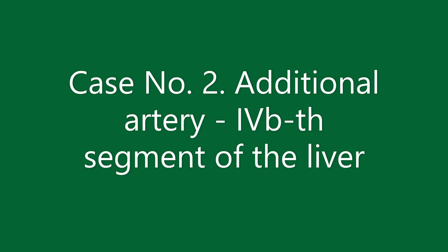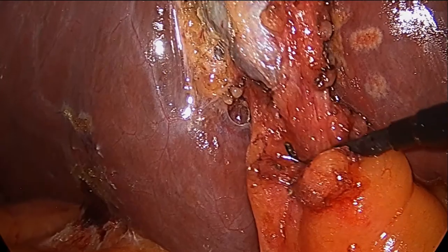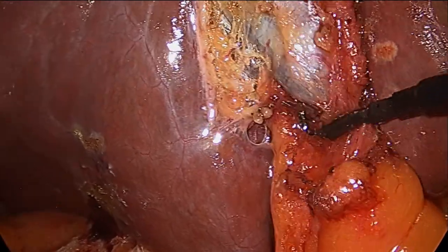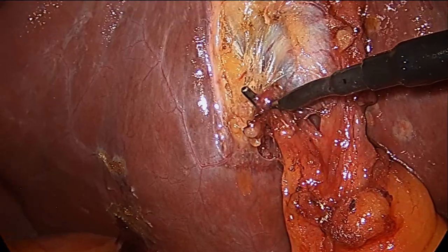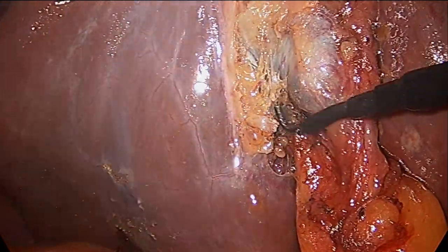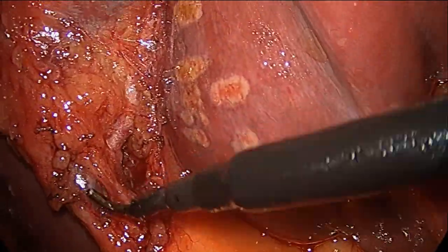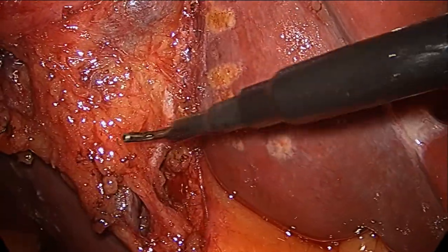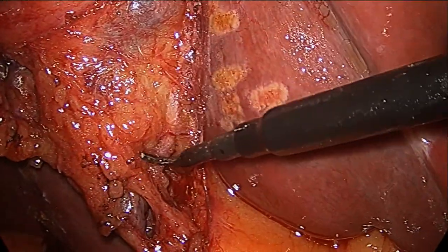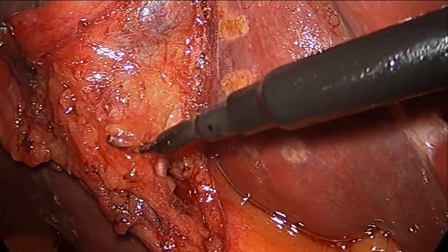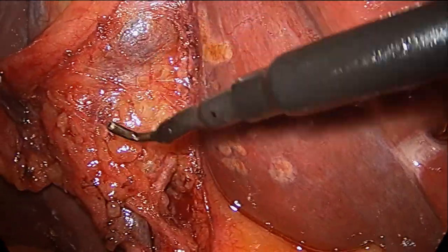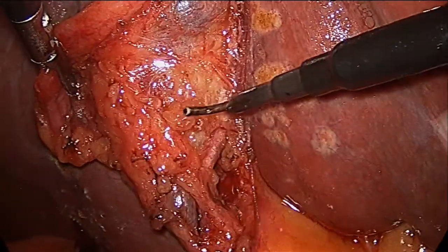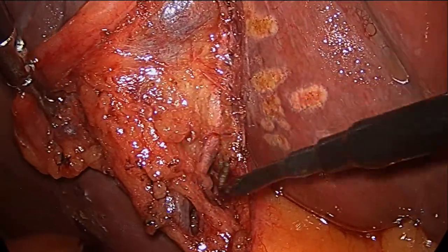The second case is an additional artery of the IVb segment of the liver. The operation was performed on a gentleman with gallbladder polyposis. We again see a typical picture — two structures are highlighted which go to the gallbladder. However, I am confused by the tubular structure located at the back wall of the gallbladder, and I again try to dissect the adipose and fibrous tissue for better visualization.